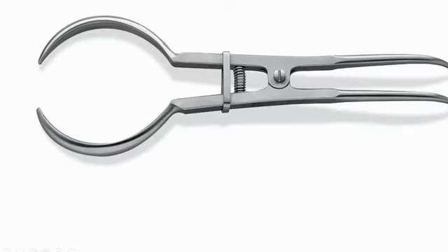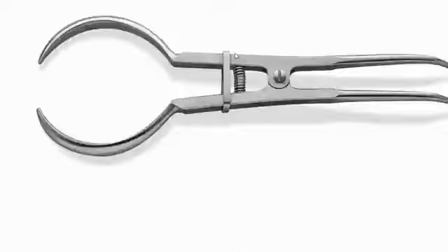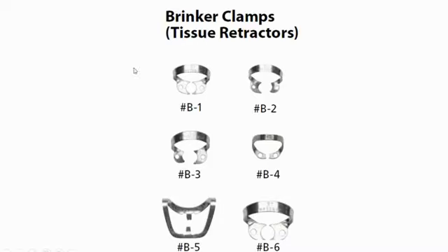You can see in this, it's a beak shape. There will be a mild, very little indentation on both the beaks, जैसे वो clamps पे अटक जाए while placing, and you can have this type of beaks also. तो different companies अलग shapes की देगी, तो the motive is same. These beaks will be attached to the holes which are there.